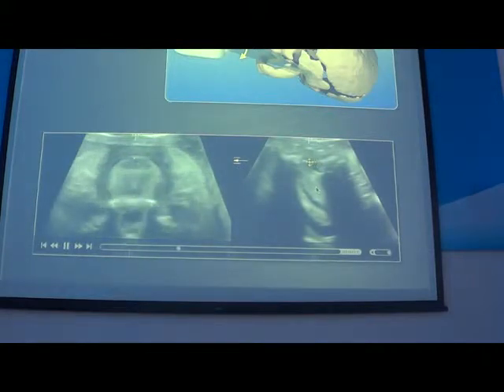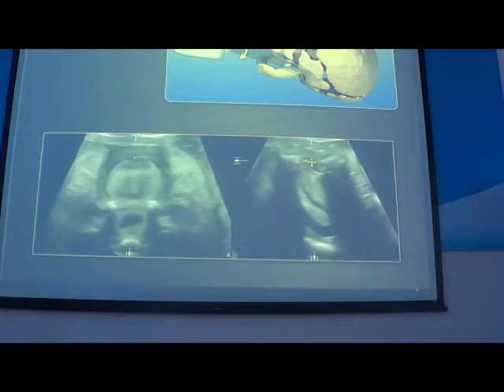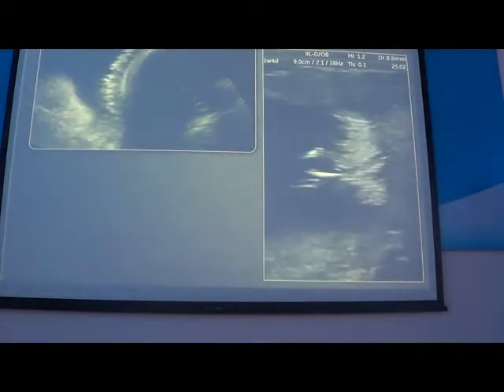Tongue. Palate. And this is a shadowing of the maxillary. And inside the volume, you can use the OmniView with this polyline OmniView. You draw a line on the palate, and you have a nice view of the complete palate and the alveolar ridge. With OmniView you can adjust this line in a curve as you want to create the slice.